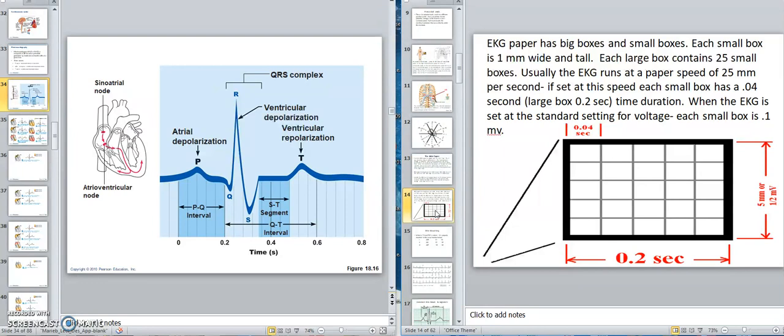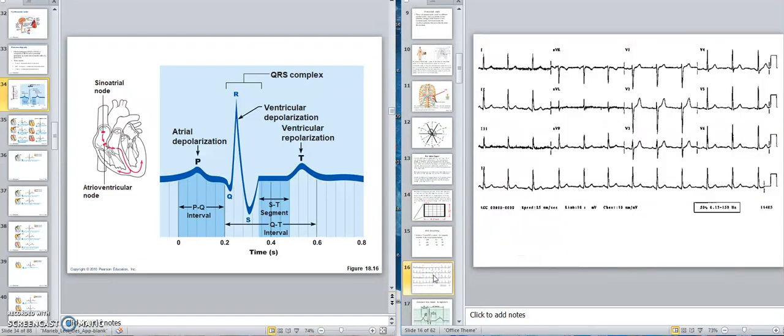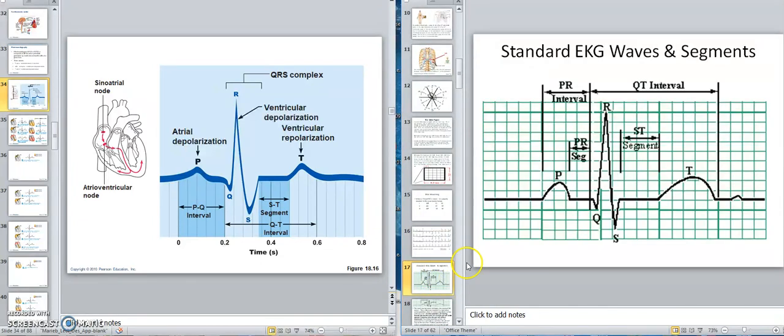It's graph paper. You're measuring action potentials, but a bunch of them. So on this axis would be milliseconds, and on this axis would be voltage, just like in AP1 when you were looking, but you're measuring several. Okay? So here would be a mounted EKG just to show you. And these are the various leads, so you're getting a look from each one just to show you what I'm seeing. Okay? Here would be the standard EKG, which is what you see here. Okay? All right.